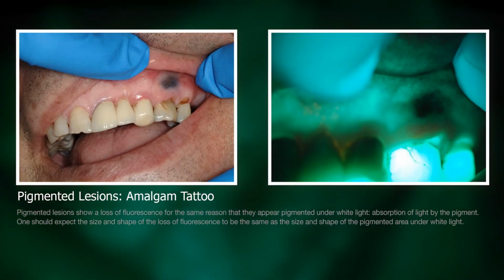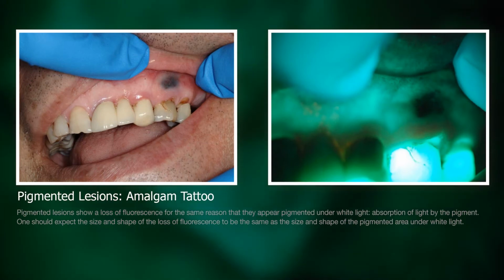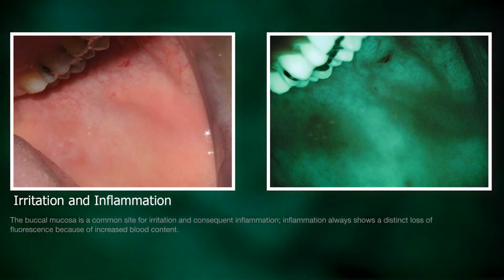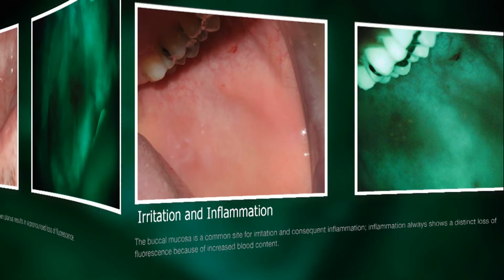Pigmented tissue, such as this example of an amalgam tattoo, appears dark under both white light and VELscope VX. The buccal mucosa is a common site for irritation and consequent inflammation. Inflammation always shows a distinct loss of fluorescence because of increased blood content.